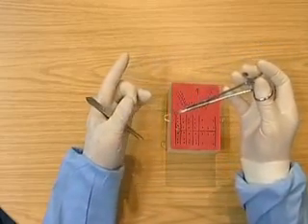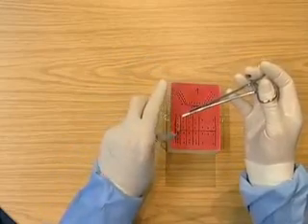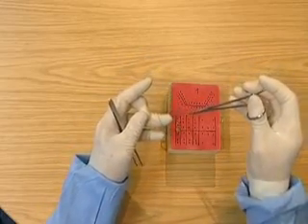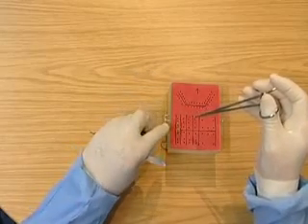Go over with the needle holders. Picking up the end of the thread. Start to wind on, running the thread down. Placing the first finger on the thread, and taking the knot away from the suture line.